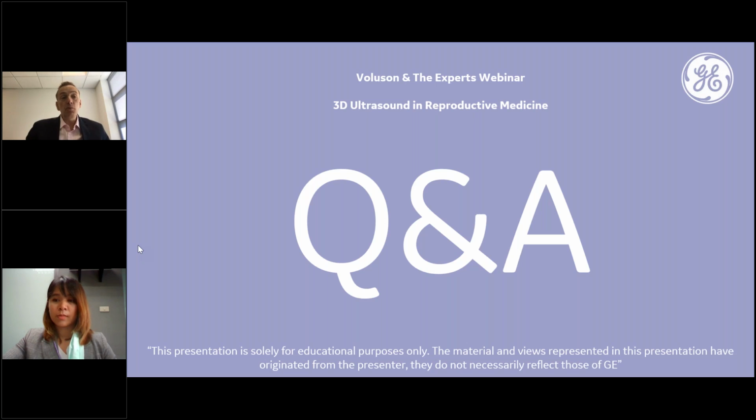So I would urge you, don't just focus on thickness. Measure it, but look at the pattern, and spend more time focusing on what the endometrium looks like and how it changes across the cycle or within the IVF cycle. I think that's one reason why a lot of the studies, and most of the work, has been done in Asia, which is fantastic data on freeze-all. What we do know now is that women likely to benefit from a freeze-all strategy are those who over-respond. But why is that? I think it's because the endometrium is out of sync. It's advanced too much because of an imbalance of estrogen and progesterone. We've got some data that we hopefully will present next year to show that.